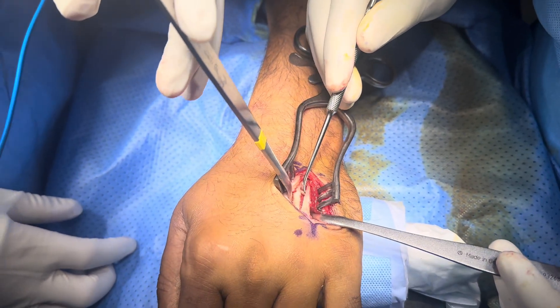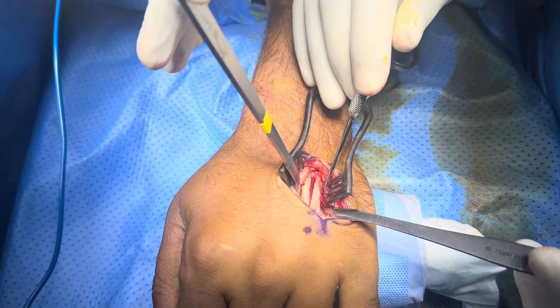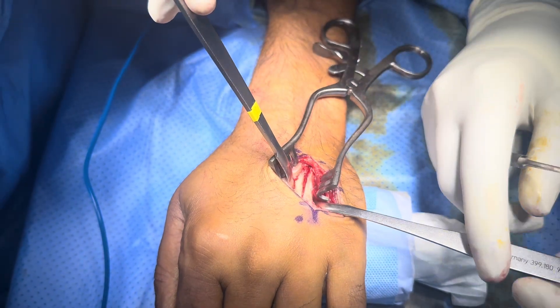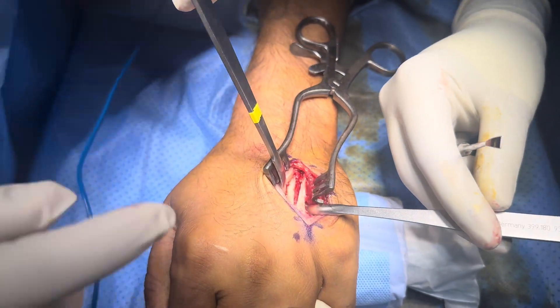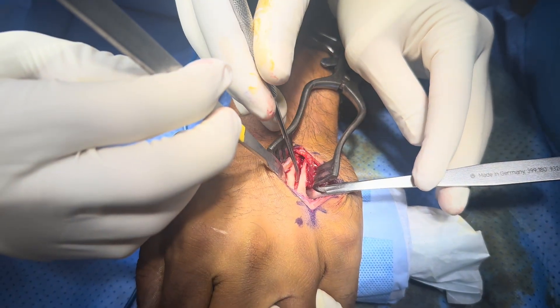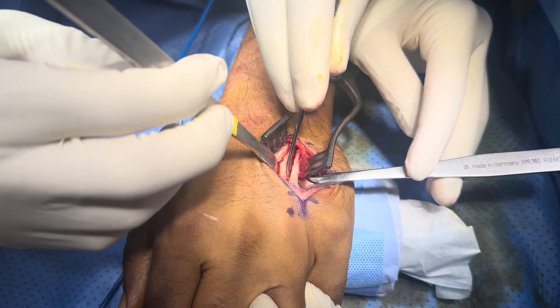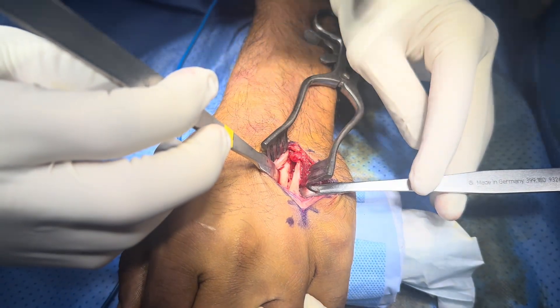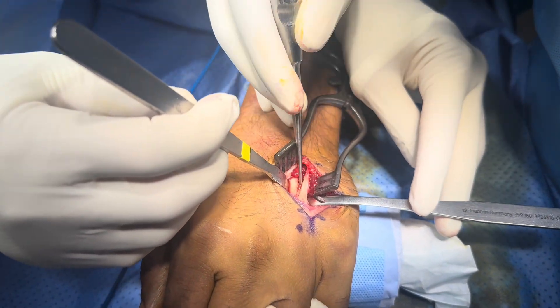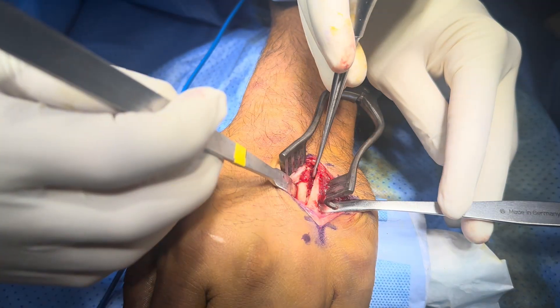Now you can see that I have opened the fracture. This is a very long fracture extending from the metacarpal head to the base — a long spiral fracture. I will curate this area because this is about 10 days old now. The best thing is to just rotate the finger laterally and you will open the fracture, which makes curettage easier. So after proper exposure of the fracture, just curate the fresh ends, we will take a wash, and then I will come back to you for fixation.